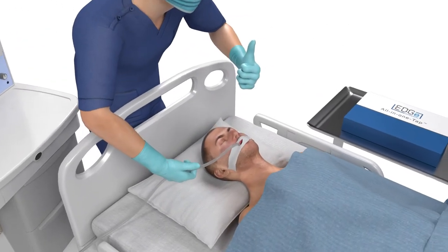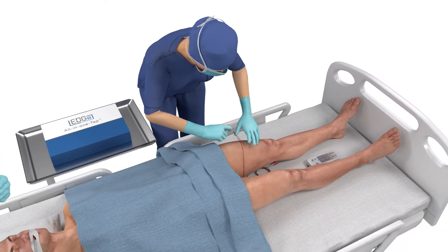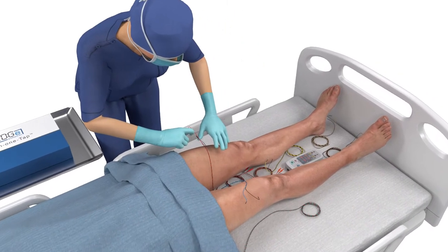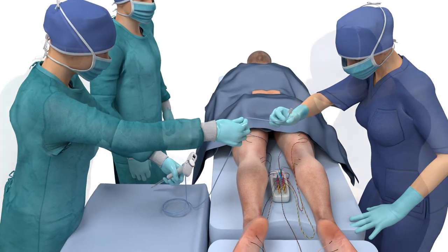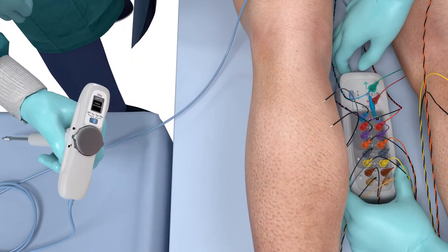Once the patient is anesthetized, an HCP places the muscle electrodes in the appropriate muscle groups correlating to the nerves being operated around. Next, the patient is positioned on the operating table and the electrodes and all-in-one tap are all connected to the smart junction box and turned on.